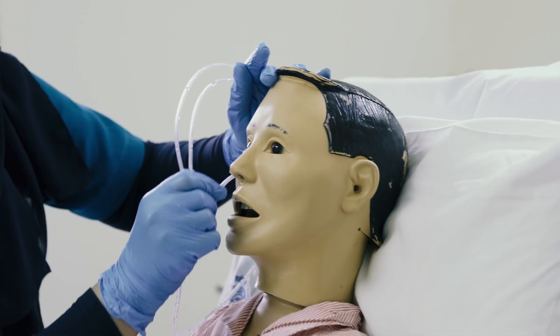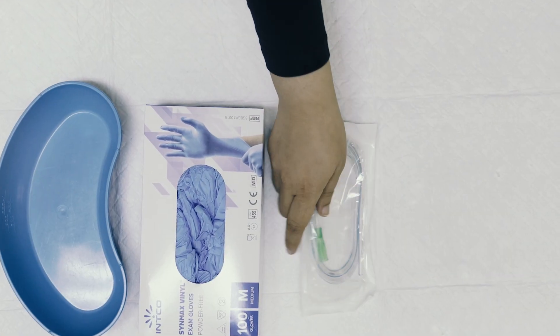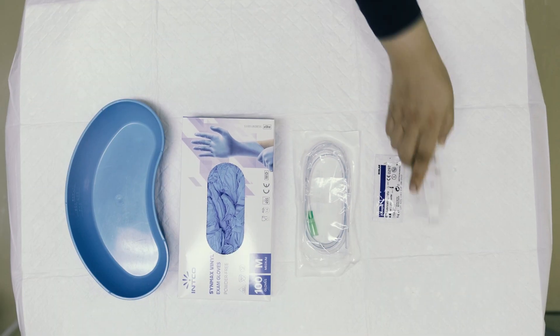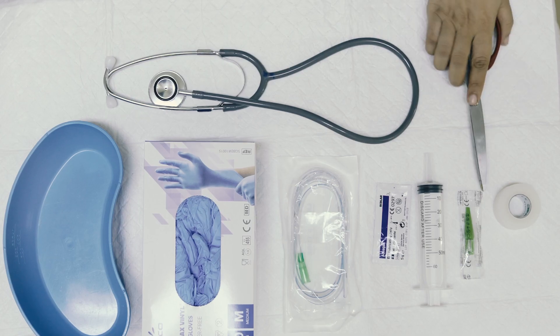The items needed for NGT insertion are: kidney tray, clean gloves as it is an unsterile procedure, NGT tube with the specific size, KY gel, tip syringe 50 ml, stethoscope, spigot, adhesive tape, and scissors.